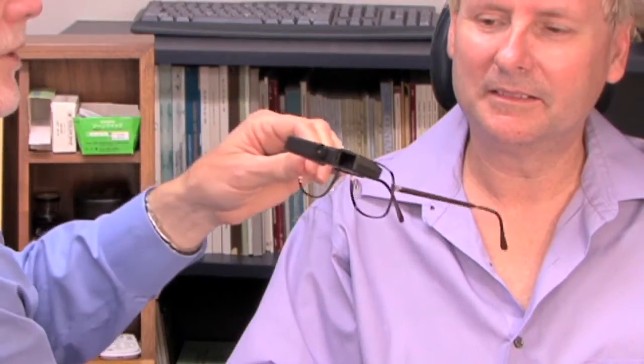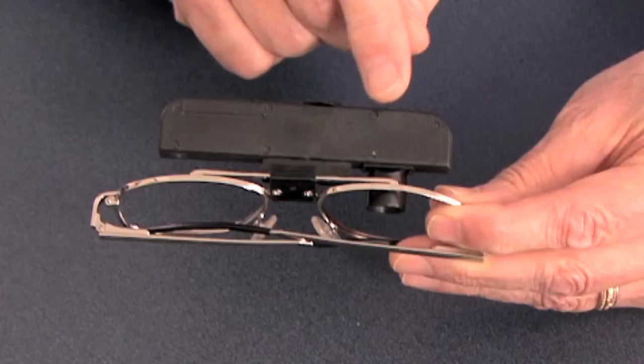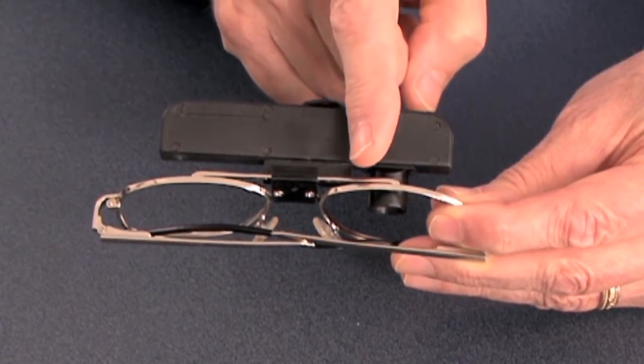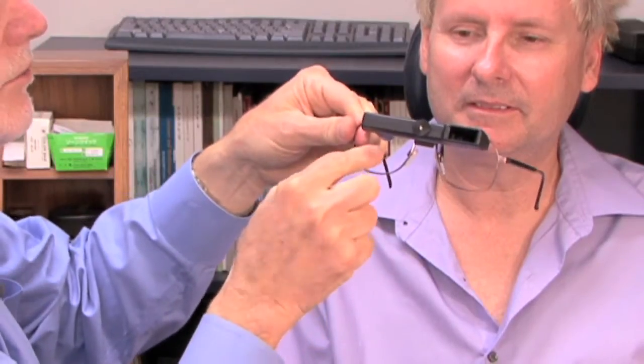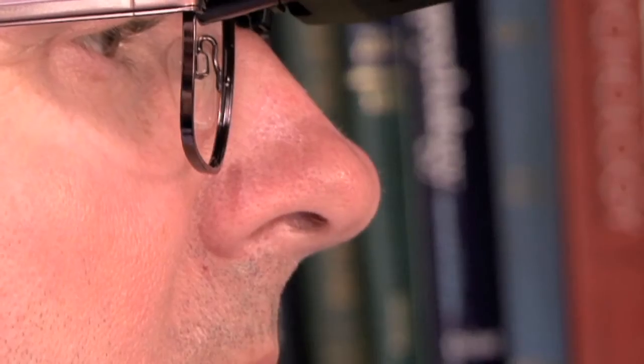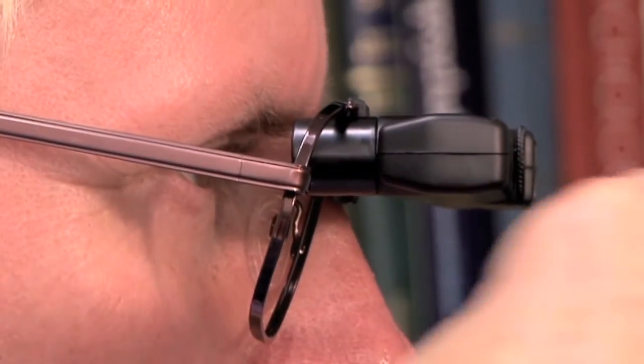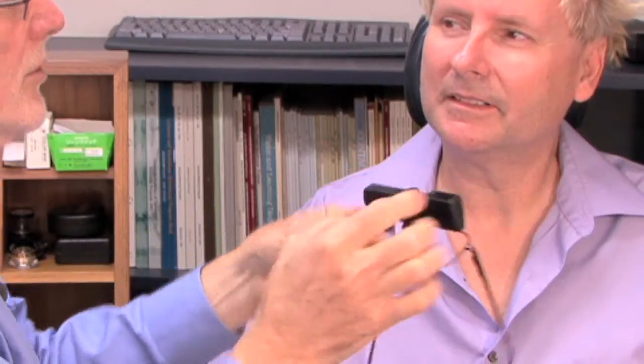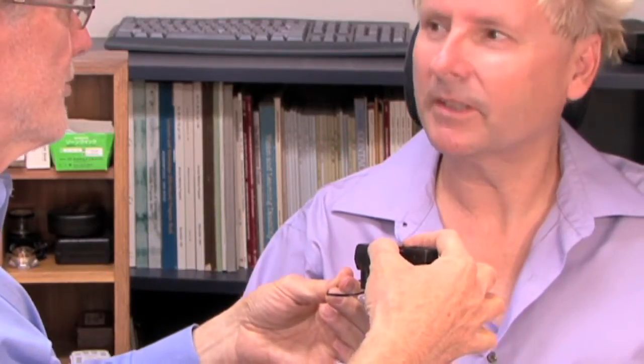I'd like to show the patient how the system works. There's an eyepiece coming through the frame. They will be looking underneath through their regular eyeglass prescription, and then they will drop their head down and look up into the eyepiece in order to get the magnified view. The focusing knob is right in the middle, pretty much in front of your nose.